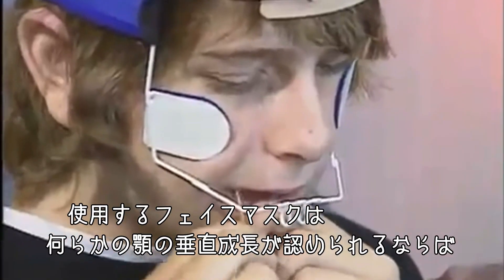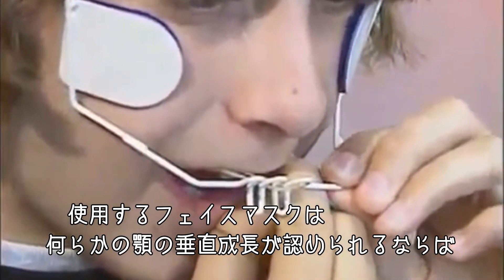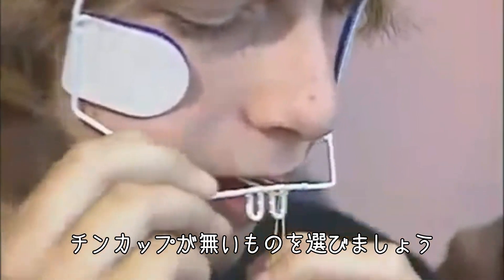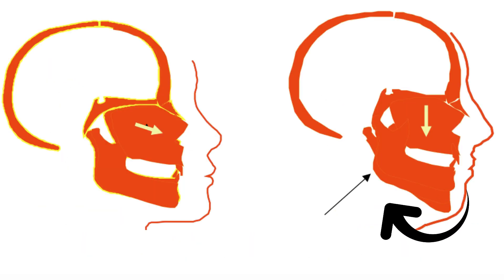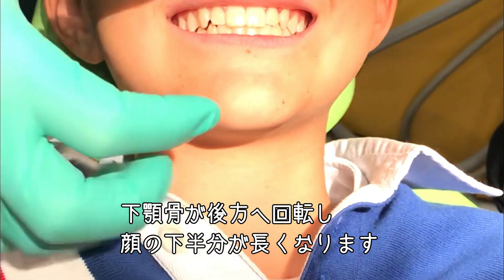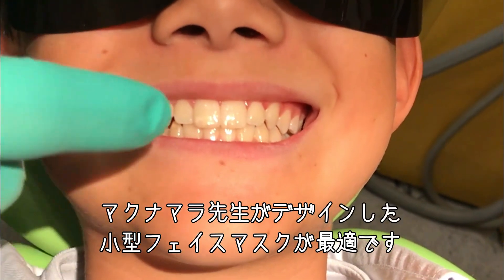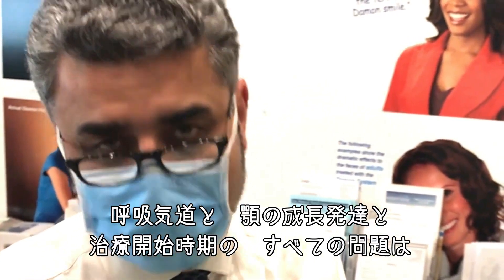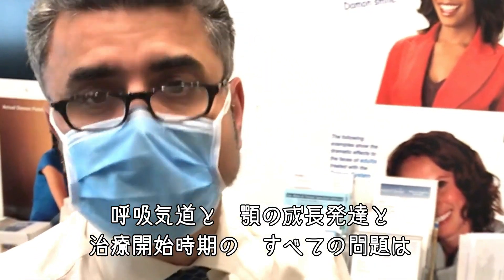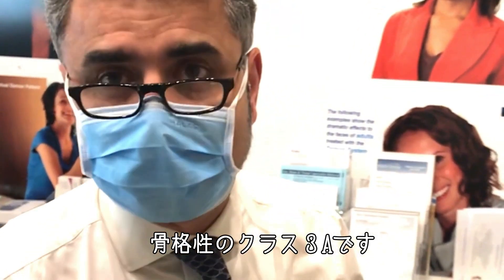The face mask I like to use — if we have any form of vertical growth of the jaw — is a face mask that doesn't have a chin cup, because the chin cup in a long face will cause the mandible to rotate back and increase lower face height. Whereas in a short face height like this, it's quite okay to use McNamara's design, which is the petite face mask. So if you look at all the issues — airway, development, timing of treatment — there's definitely an indication for phase one in class three maxillary deficient patients, what we know as skeletal 3A. That's the clinical tip for today.